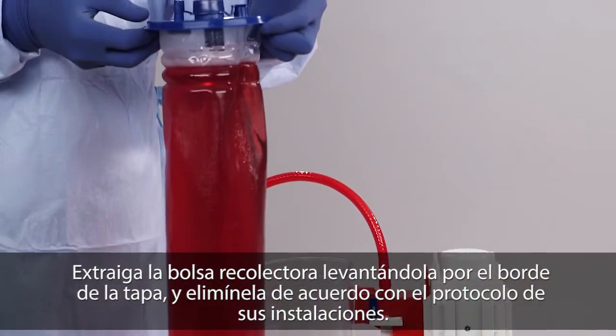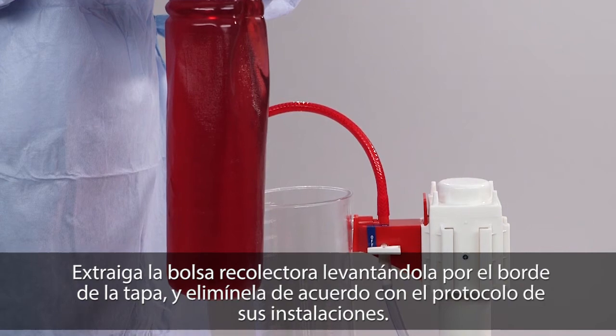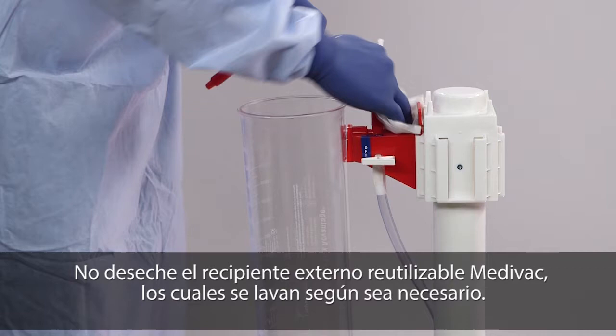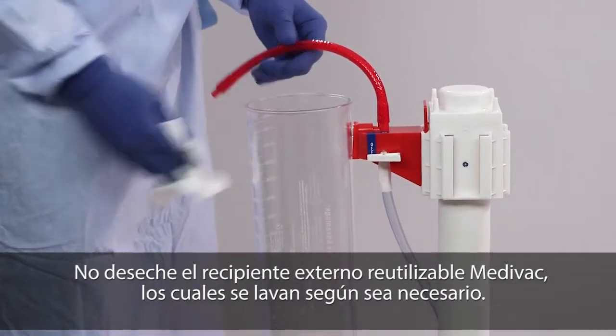Remove liner by lifting upward on the rim of the lid and dispose of in compliance with your facility's protocol. Do not discard the reusable outer canister. Canister may be cleaned as needed.